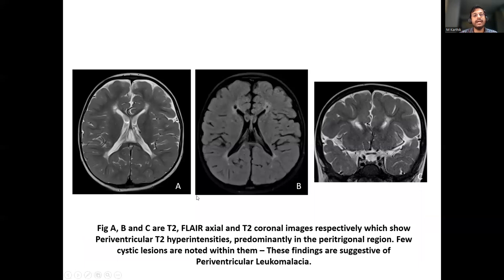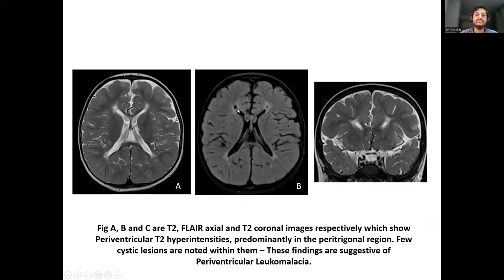Figures A, B, and C show T2 axial, FLAIR axial, and T2 coronal images with periventricular T2 hyperintensities predominantly in the peritrigonal regions, with a few cystic lesions also noted within them. These findings are suggestive of periventricular leukomalacia.